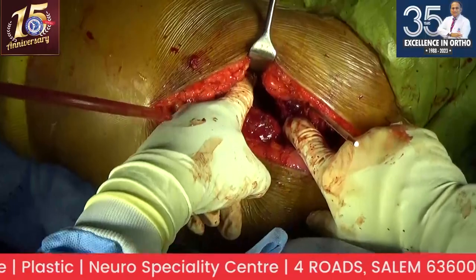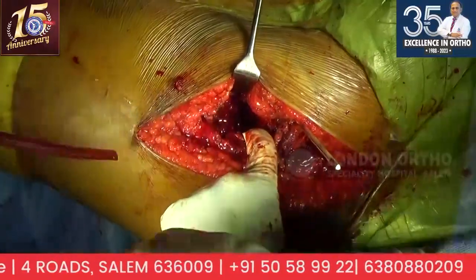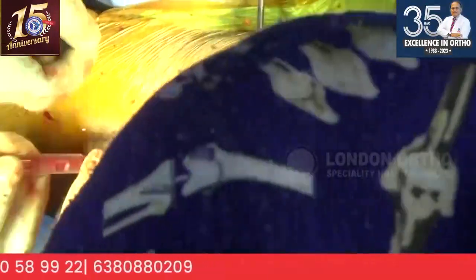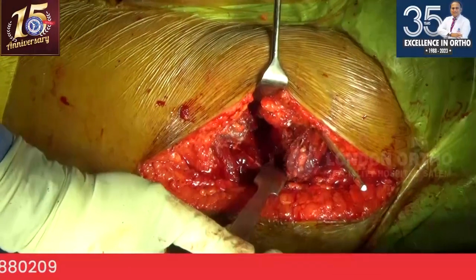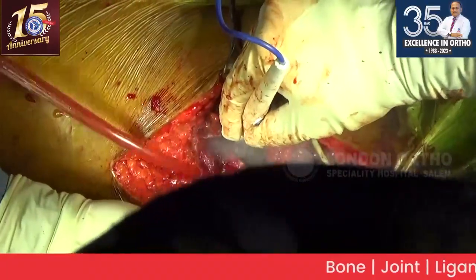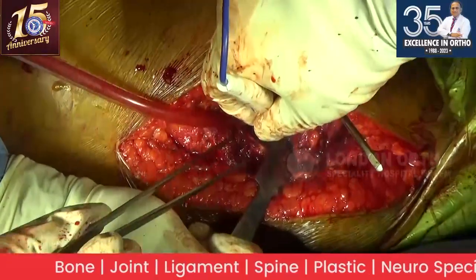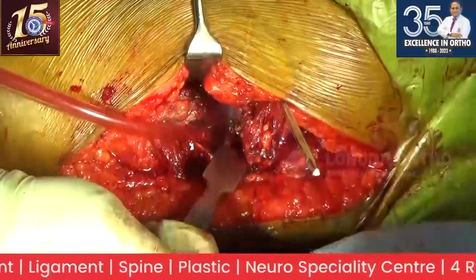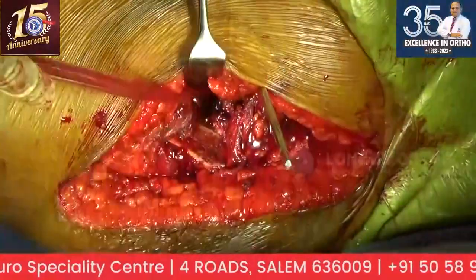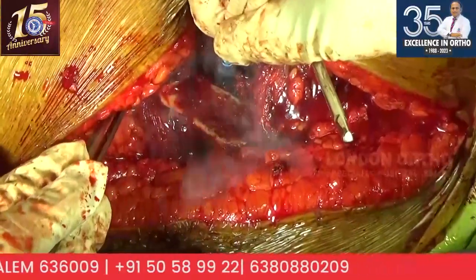Do you agree with that, or should I do any more release to get more? Sir, have you released the posterior capsule completely? Yes, I have. Okay. I'll show you. Turn around. The posterior femoral I'll release now. This is posterior femoral side I am releasing.